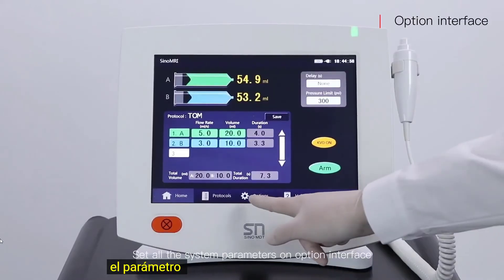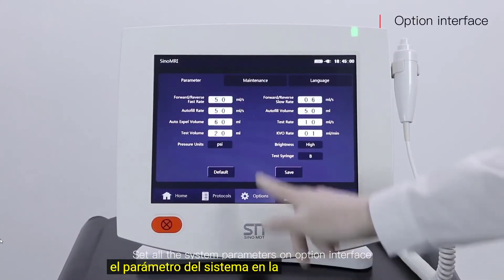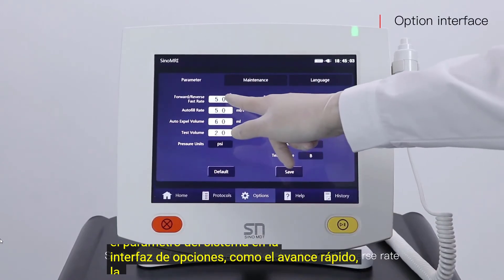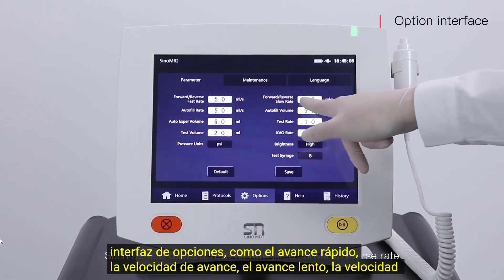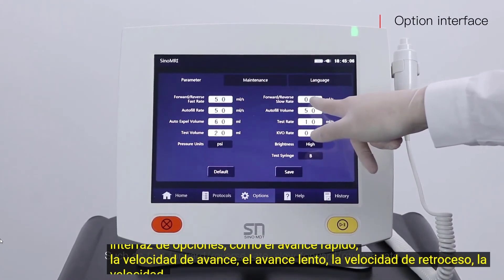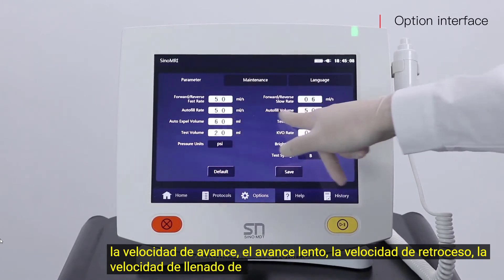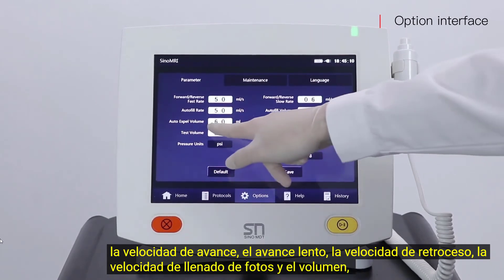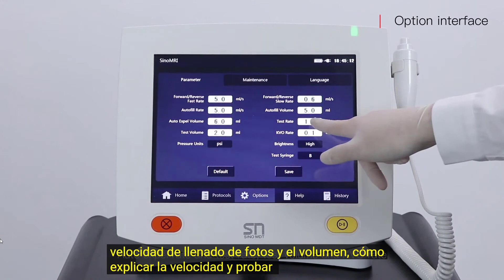Set all the system parameters in the options interface, such as fast forward and reverse rate, slow forward and reverse rate, auto fill rate and volume, and auto expel rate and test rate.